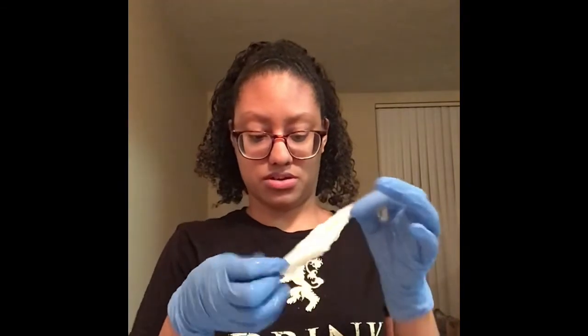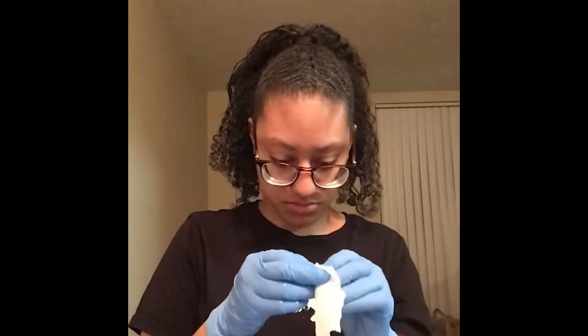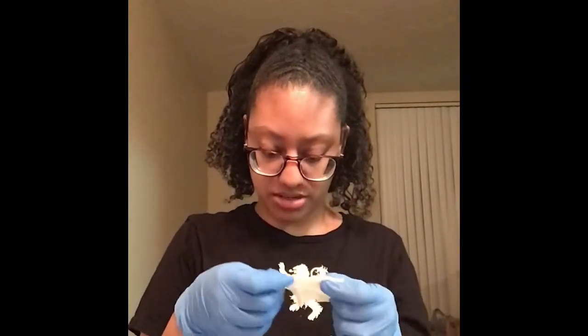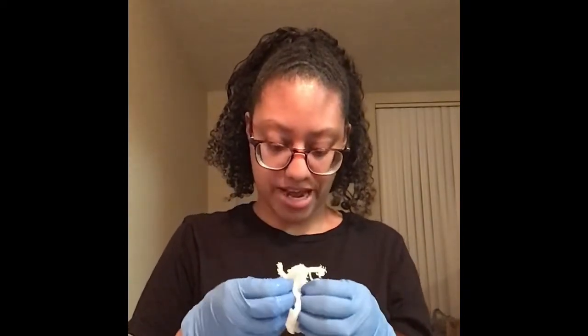Next thing we are going to be doing is we are going to pack our wound. So you want to grab your Curlex out of the solution and packaging. You want to squeeze it out so it's not soaking wet. You just want to rearrange your Curlex so that it will be easy to pack.